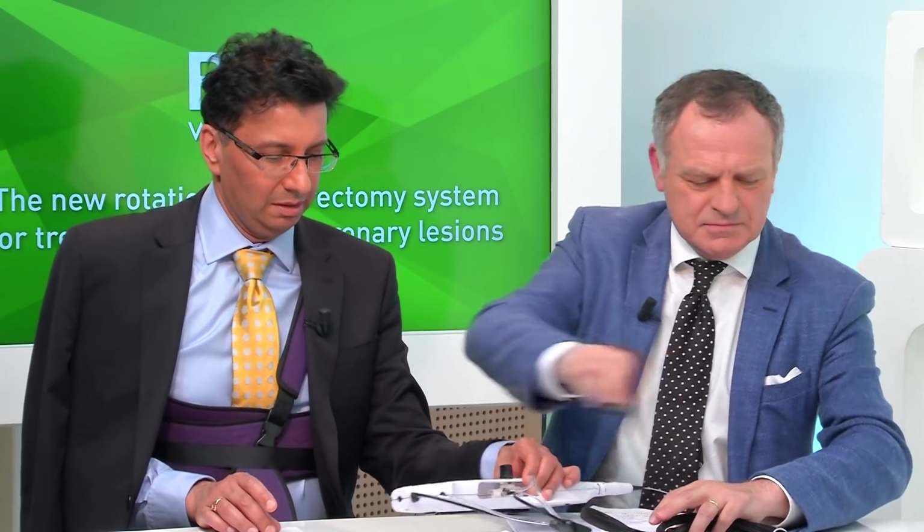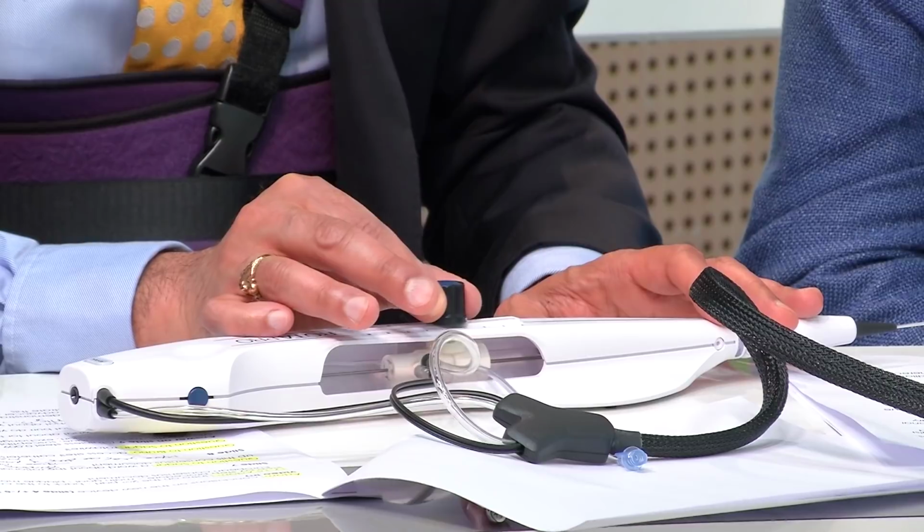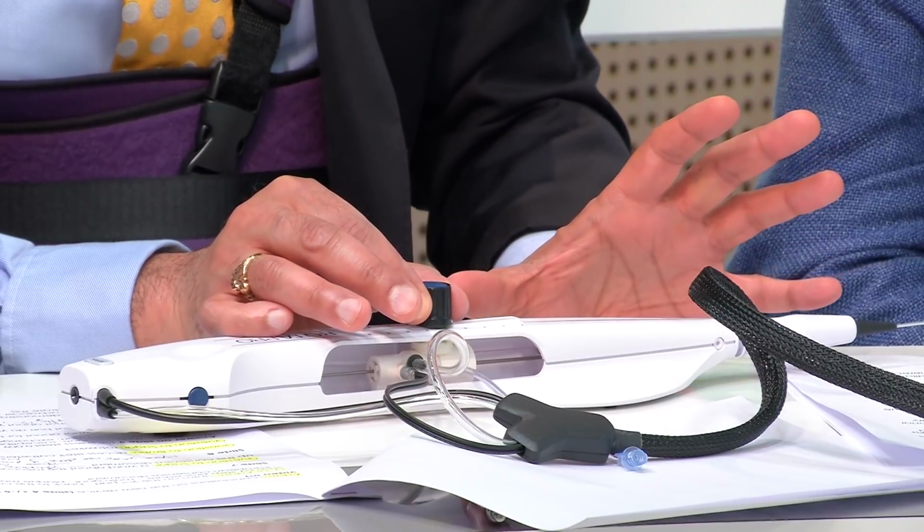Absolutely. Perhaps I could ask you to use the advancer, Sagar, to just see what your technique is like, and what the dottering or pushing or perhaps the pecking technique. So the optimal technique is one of a gentle pecking motion where you are applying mild pressure. You have to apply a little bit of pressure, but obviously you've got to be quite gentle with that. You're also watching, and your technicians are telling you about the burr speed. So it's a gentle forward pecking motion and keeping your runs to around 15 to 20 seconds.